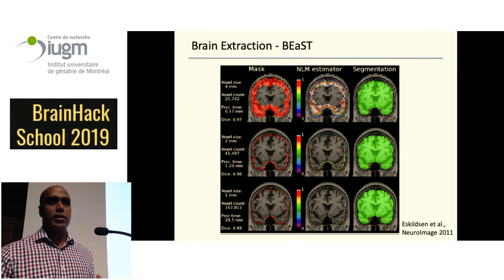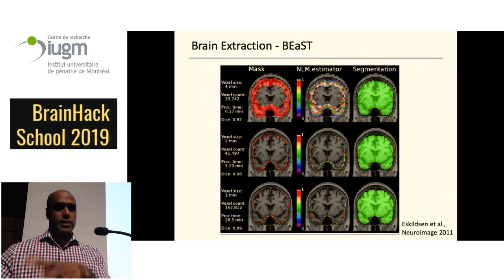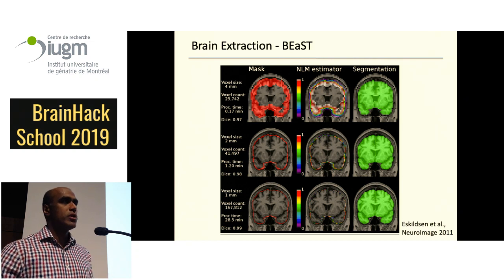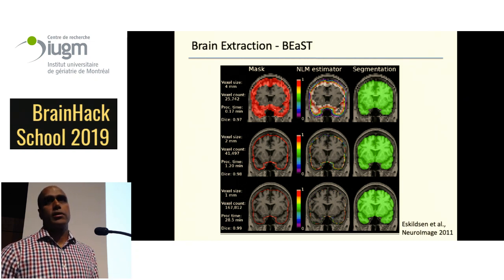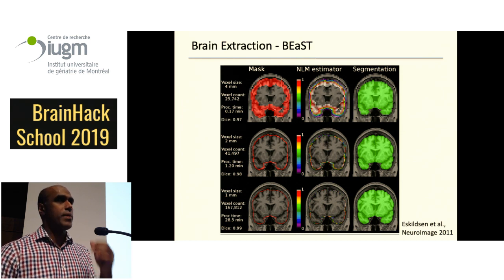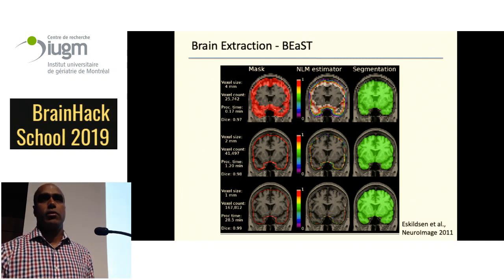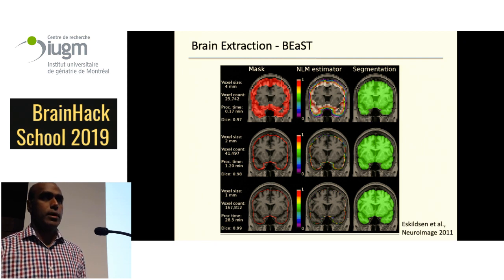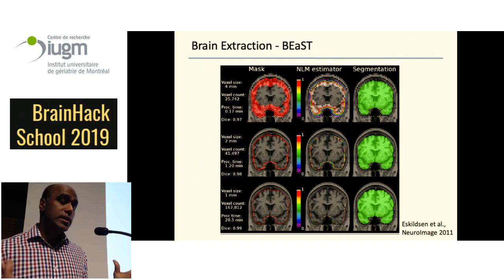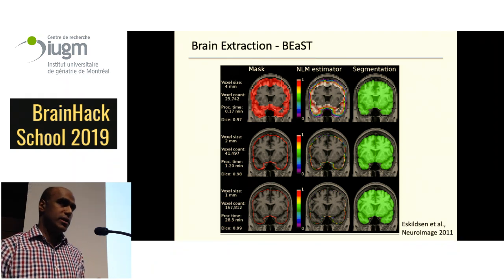We've added some neurodevelopmental data, so it's quite easy to get it to grow pretty fast, and it's really adept at picking out the templates in that library that are most like your image, based on field strength, morphological characteristics, and intensity characteristics, and then does an iterative estimation in order to create a brain mask. We find it a lot easier to use than at least the previous version of BET. I haven't played with the more recent ones. Because we can tweak it to different populations, we find it quite helpful and quite robust. We often use this as a pre-processing step, and find it more robust, at least with the constellation of tools I'm describing, than some of the pre-processing tools available in CIVET or FreeSurfer.